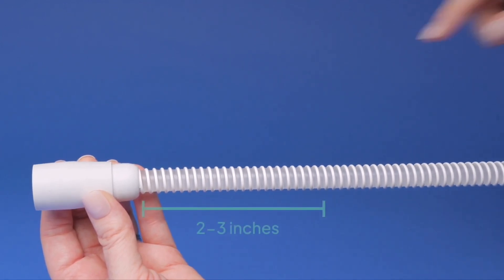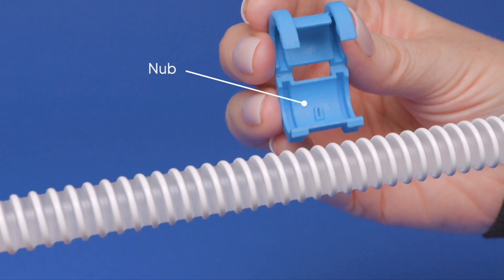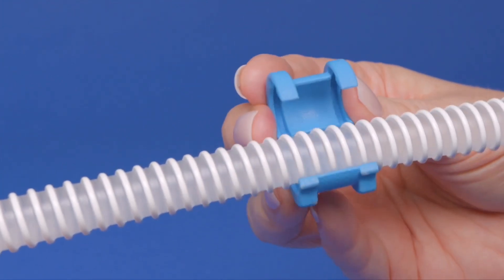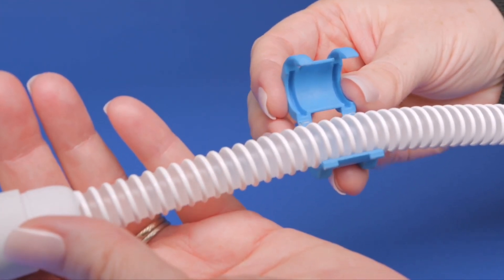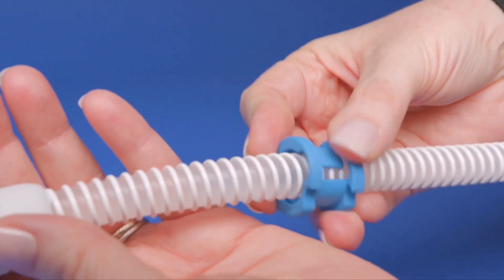Position the hose sleeve 2 to 3 inches from the connector. Position the hose on the nub side of the hose sleeve. Slide the hose until the sleeve clicks into place between two of the hose ribs. Close the hose sleeve.